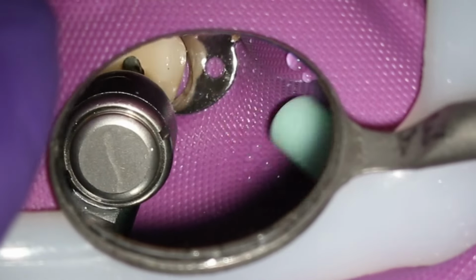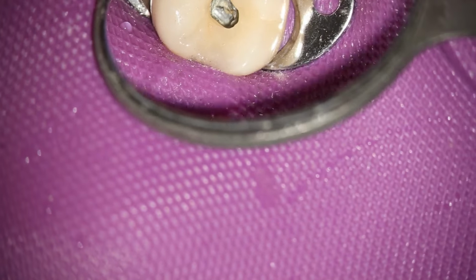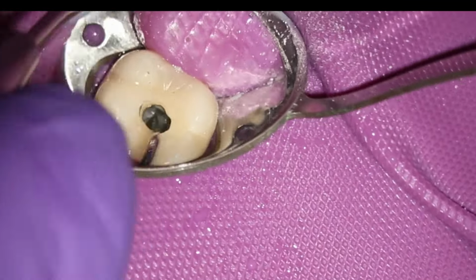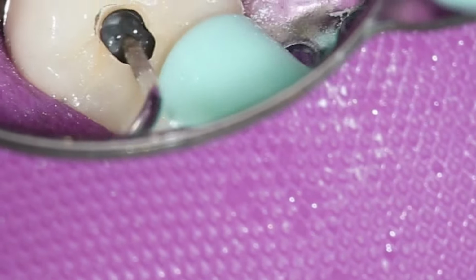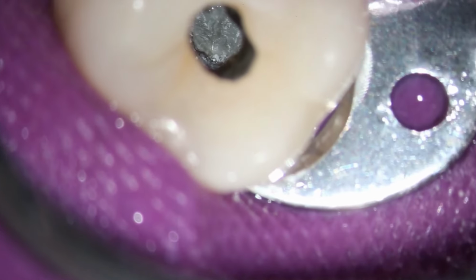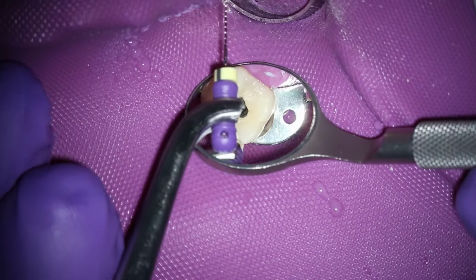Here's the initial. Now this was a very calcified case, so I want to make a very accurate access, and I want to really study this very carefully before I go any further. And so your mirror, when you're studying it, is up close to the tooth where you can see it, but then when you're drilling, it's down near the bottom of the dam. So just to walk you through the case, I'm looking at minor changes in color and texture, going in with the ultrasonics, using that as kind of a drill to blow away the calcified material. And then I look at it and I can see the telltale signs of the MB2 and the line there, and I find it, and I'm actually able to get an instrument in.